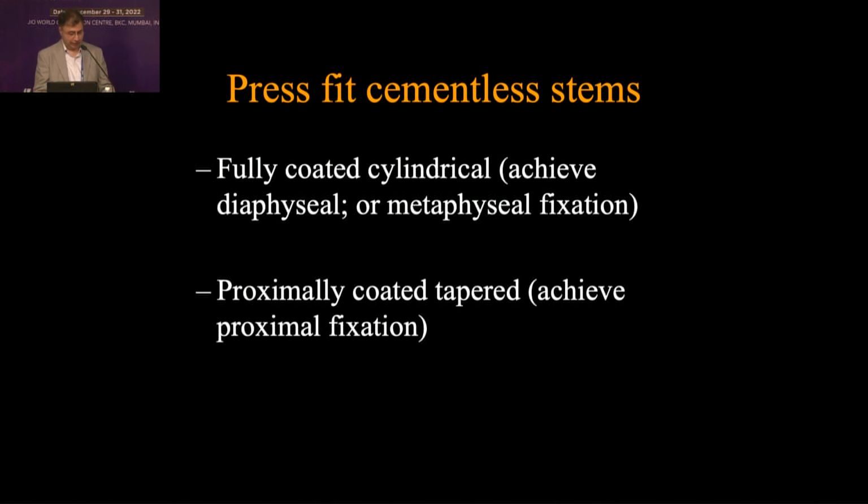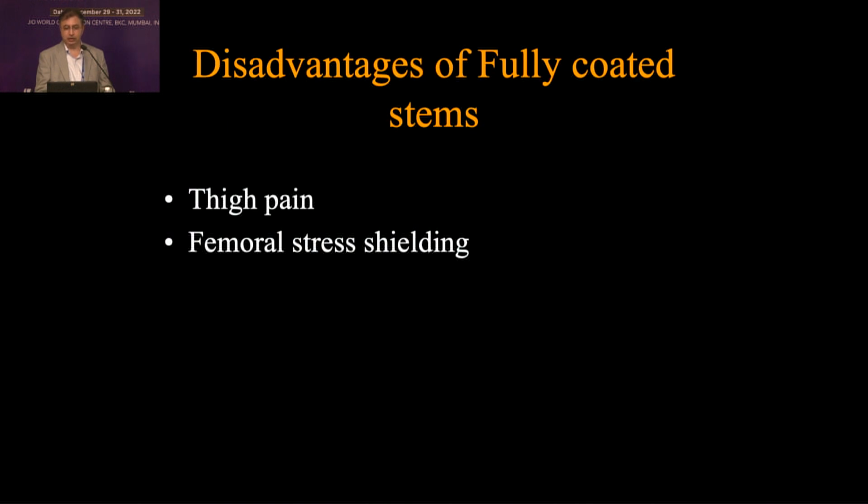Now, there are different kinds of cementless stems. You have the fully coated cylindrical, which could achieve diaphyseal fixation, or, largely in this part of the world, the one that we use is the one that achieves metaphyseal fixation. Or you could have a proximally coated tapered stem, which achieves a proximal fixation.